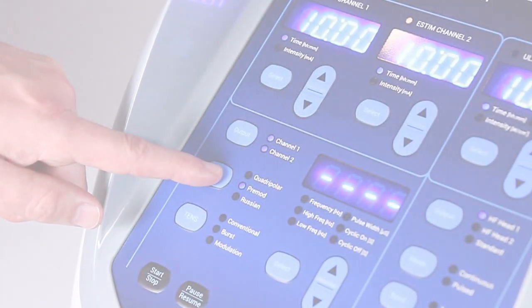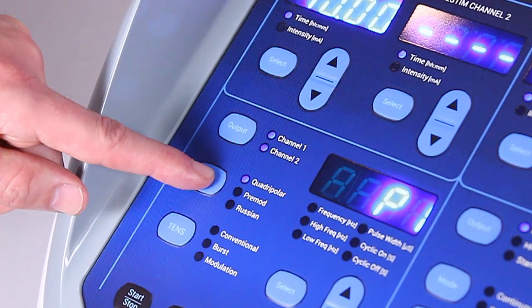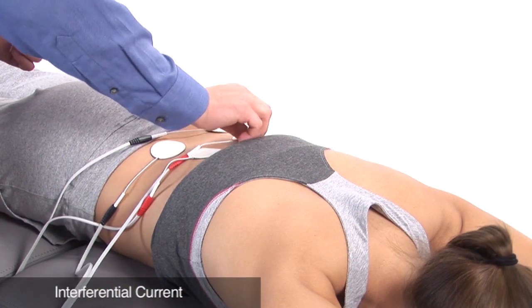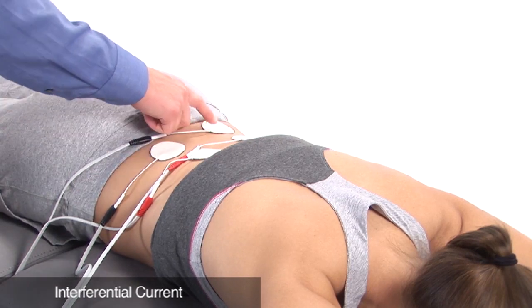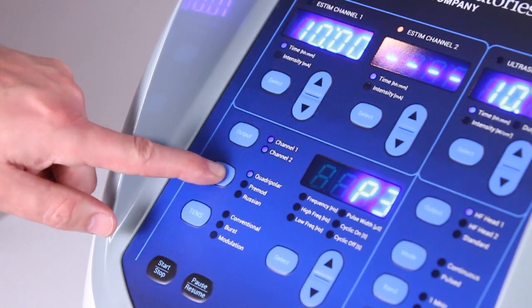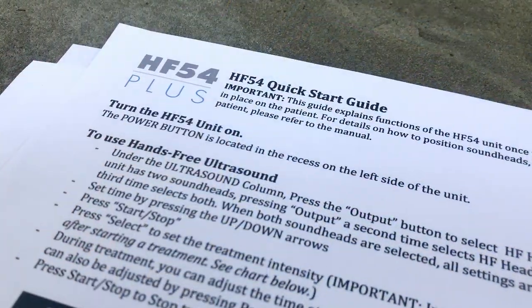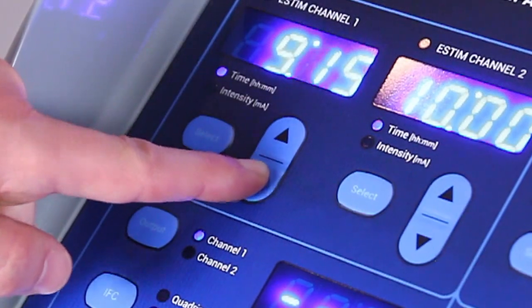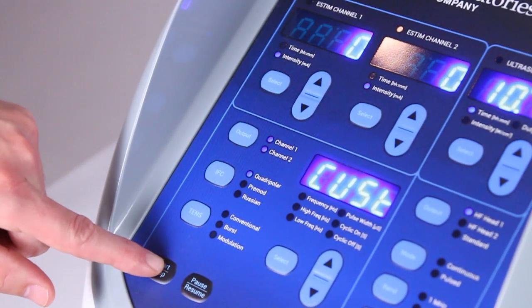With both channels selected, press the IFC button to select quadripolar. Place four electrodes onto your patient in an X configuration. Each channel should be positioned diagonally from one another. Quadripolar treatment includes five presets from P1 to P5 and a custom setting. See our quick set guide for details. Set the time, press start, and then adjust intensity to your choosing.